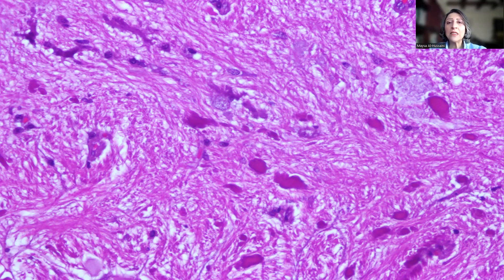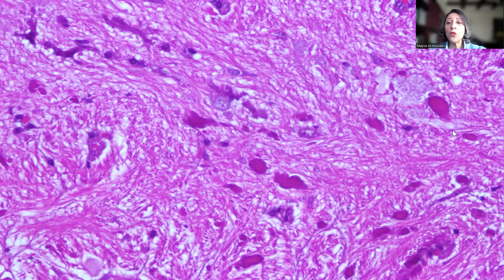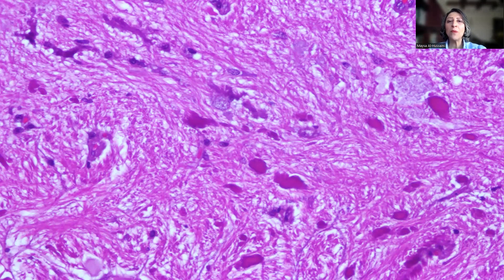But this gliosis in itself is not the lesion. Around ganglion gliomas, craniopharyngiomas, and hemangioblastomas, you will find this type of reaction. You have to be aware of this gliosis with Rosenthal fibers because it might sometimes be mistaken for the lesion itself. So you have to be aware of this potential pitfall.